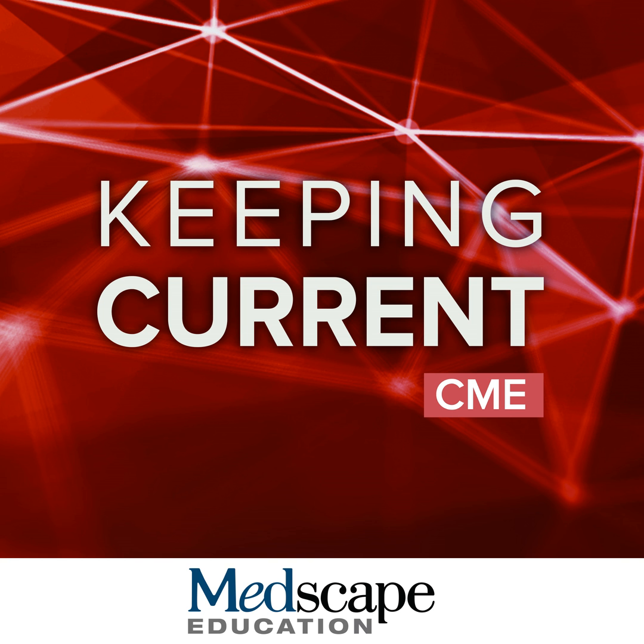For example, we need to provide a specific number of microhemorrhages in order, again, for the treating provider to have an accurate risk assessment. So rather than few scattered cerebral microhemorrhages, it's important to identify, are there 4 or are there 5, 6, or 7 microhemorrhages?